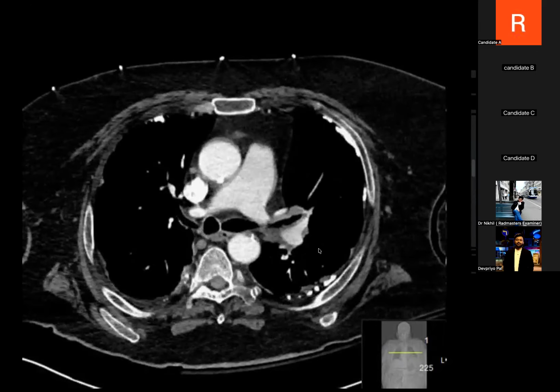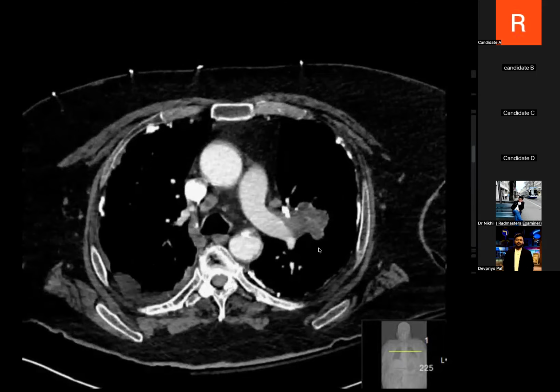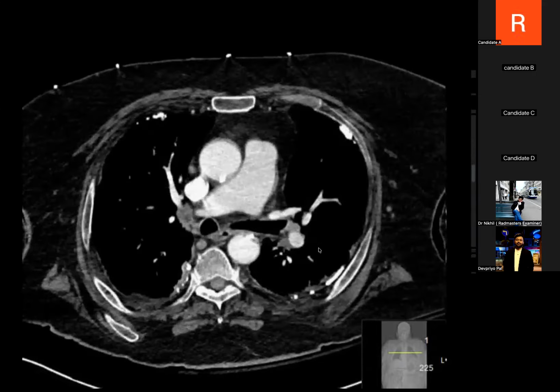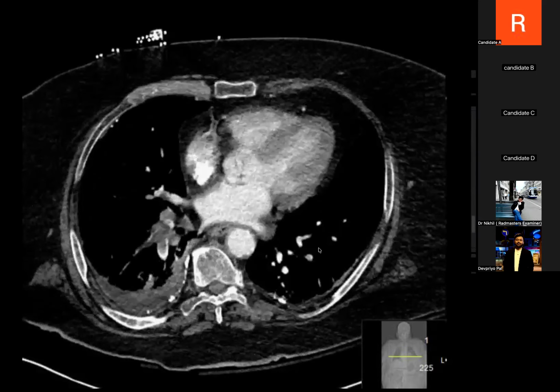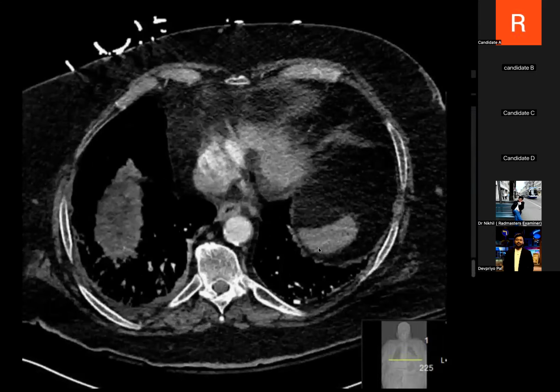This is a vascular emergency. I would urgently pick up my phone and call the referring physician immediately. This patient needs urgent anticoagulation. And for the mass lesion, I would compare with previous imaging, and proceed with lung MDT discussion and image-guided biopsy for further treatment planning, as well as CT abdomen for staging.